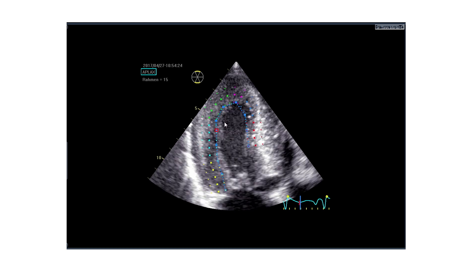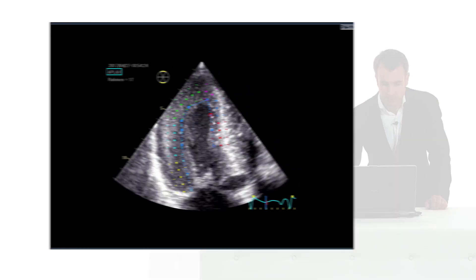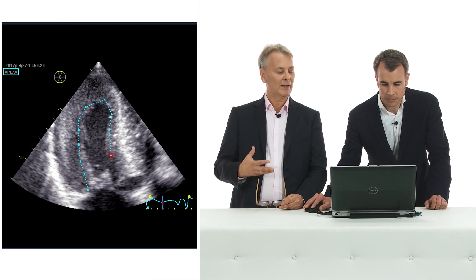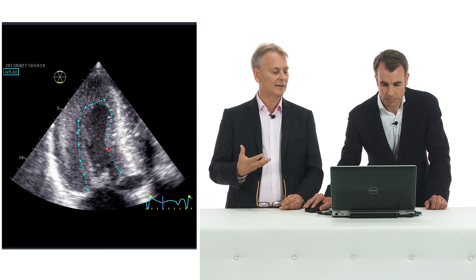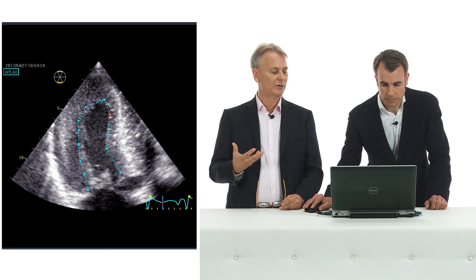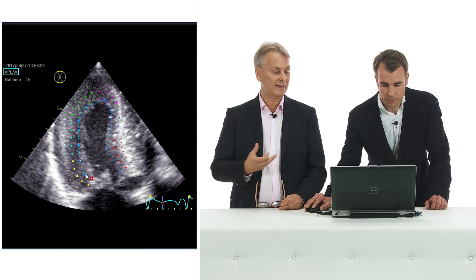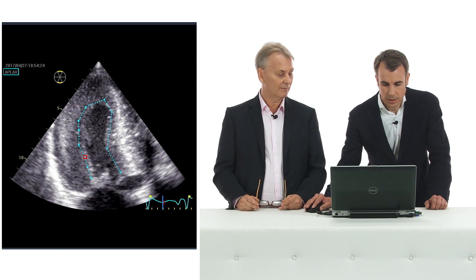Just while you're tracing this, my question would be: how do you actually solve the problem that the myocardium is a different thickness in different parts? Do you care? Do you always try to trace the entire thickness of the myocardium?